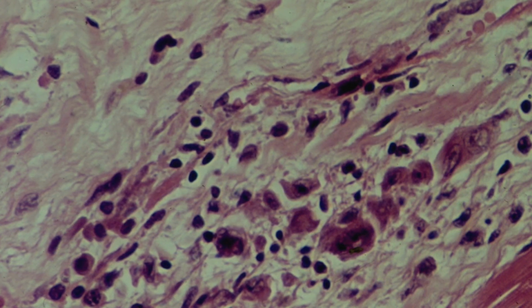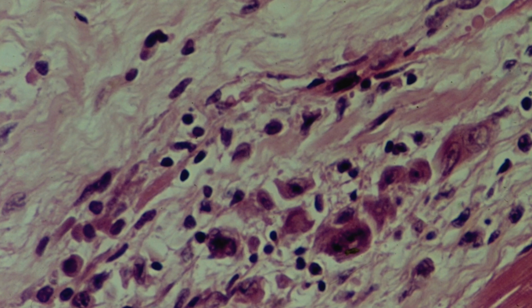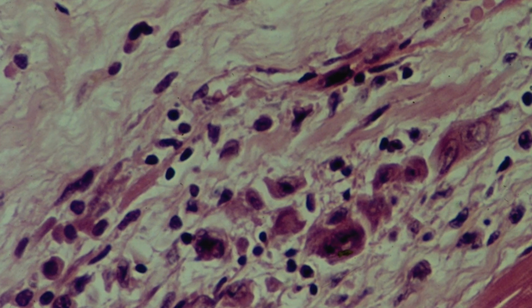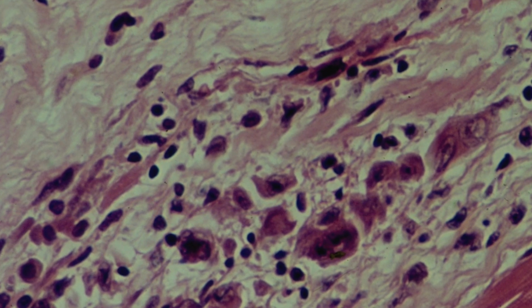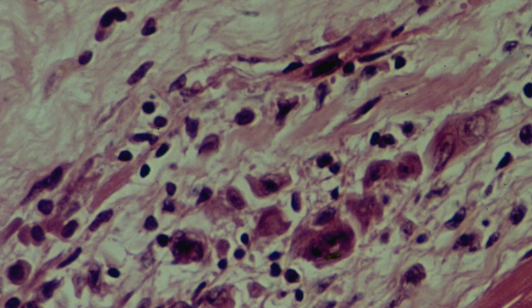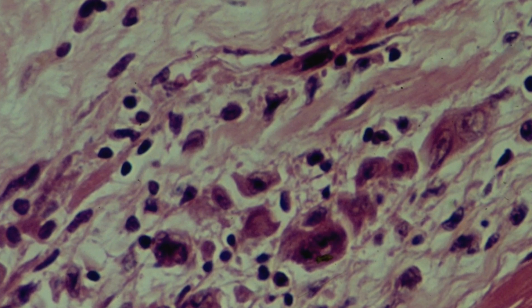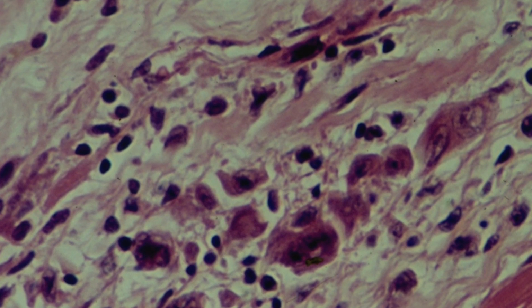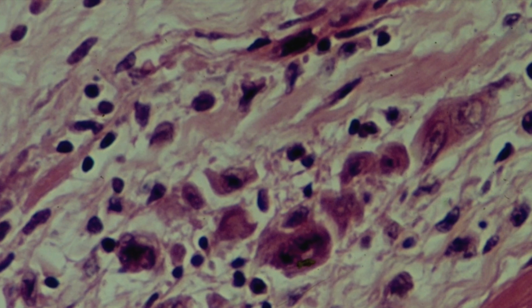Here is another higher power view of the Aschoff body. There are a number of these large cells that are binucleate with abundant cytoplasm that is slightly basophilic, and the nuclei contain prominent nucleoli, resulting in an owl-eye appearance. And scattered between these cells are lymphocytes.